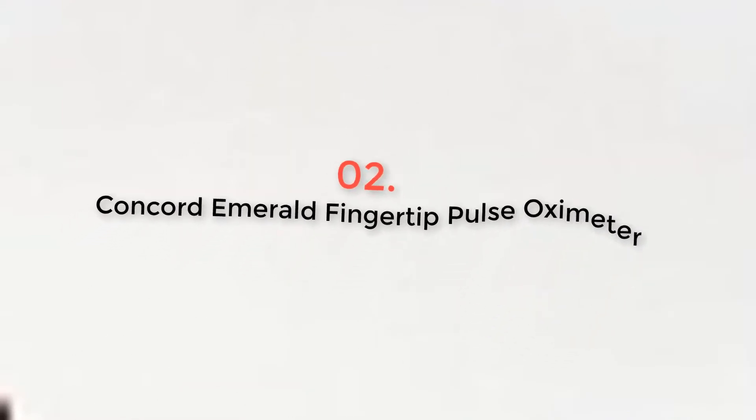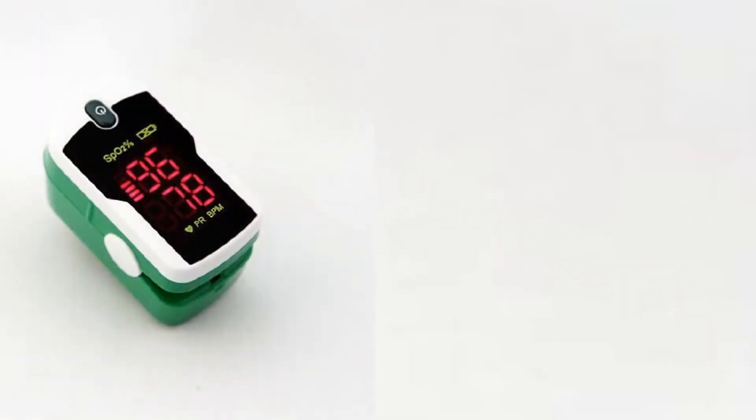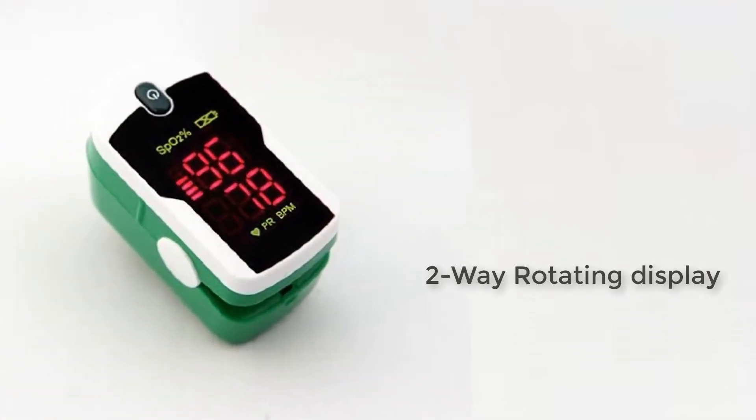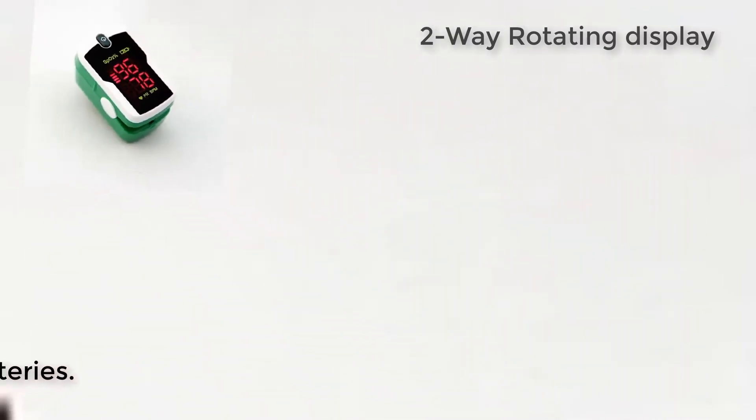Product Number 2: Concord Emerald Fingertip Pulse Oximeter. The first thing that needs to be mentioned about it, and that has really impressed us, was the fact that it has a lifetime warranty.